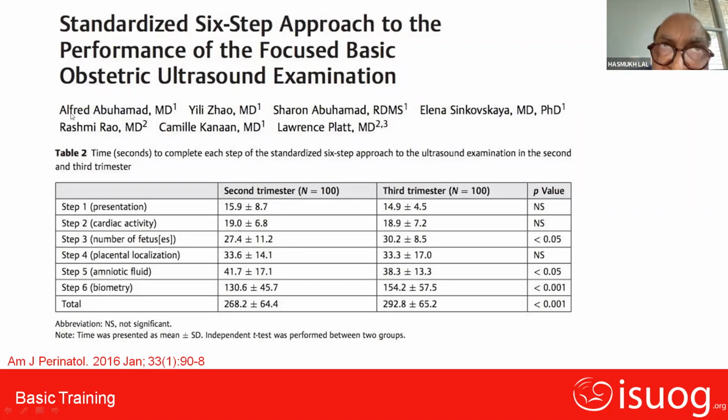As far as Dr. Ajit said about grading of placenta, we are not grading placenta these days because of the importance of the Doppler. We are able to measure placental function, and grading is just an observational study, whereas Doppler studies give you a 100% functional study. It tells you in detail how things are going on. That's why we are no more grading placenta these days.